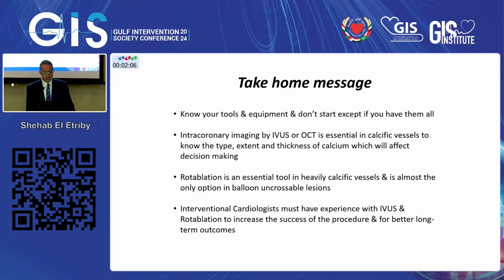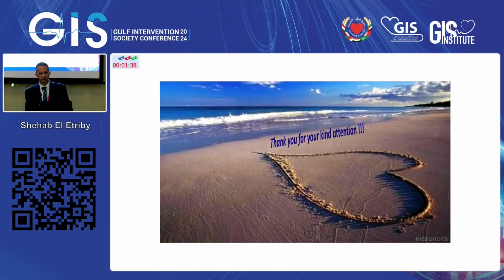Rotablation is an essential tool in heavily calcific vessels and is almost the only option in balloon uncrossable lesions. We don't have a laser in Egypt. So rotablation is essential in the heavily calcific vessels. Interventional cardiologists must have experience with IVUS and rotablation to increase success of the procedure and for better long-term outcomes. Thank you.